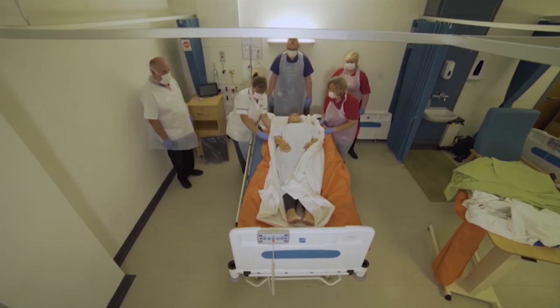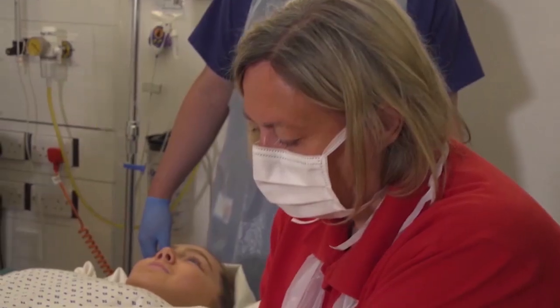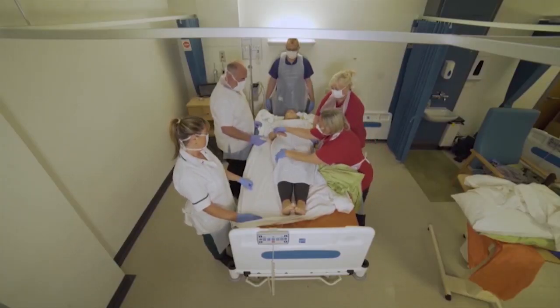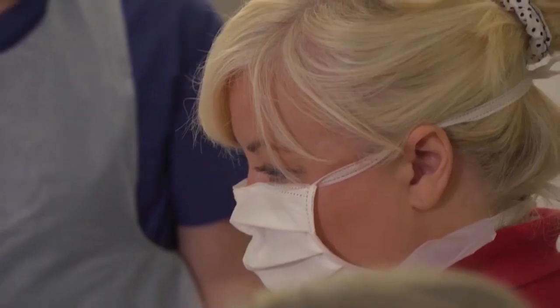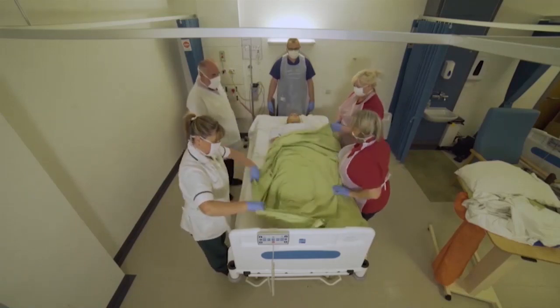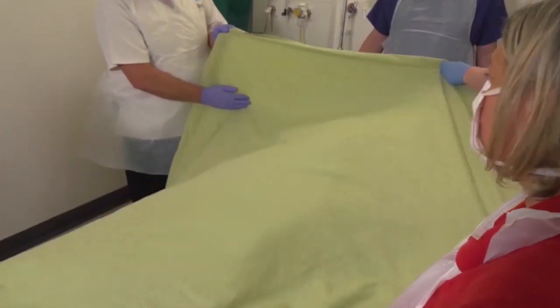Ready, steady, pull. Got a little bit left there. First of all, tuck that arm underneath the person. I'm going to get one sheet and the people at the top are going to get the sheet and fold it back on the person.